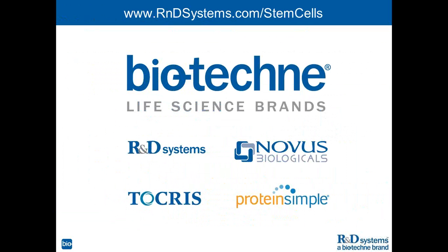Okay, we have another question just popped up. Which of your kits require monolayer of single cells or embryoid bodies as the starting material? So does it make a real difference, Joy, whether you've got a monolayer or an embryoid body? It can make a difference. All of our kits are designed for monolayer culture. So I think that takes a little bit of the variability out when you can do it in an easier monolayer culture, plating them. Generally, for most of our protocols, you want to plate them at a density for that cell line that they will be 80% confluent the next day, so you can then start the differentiation.